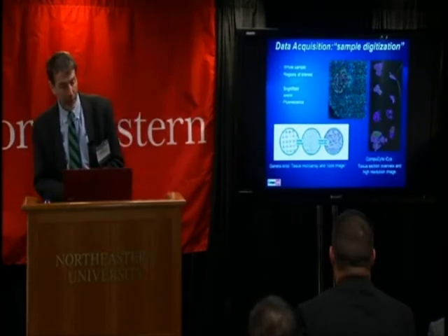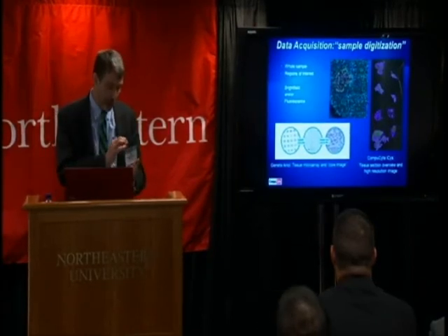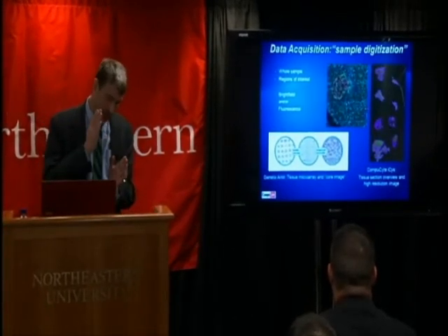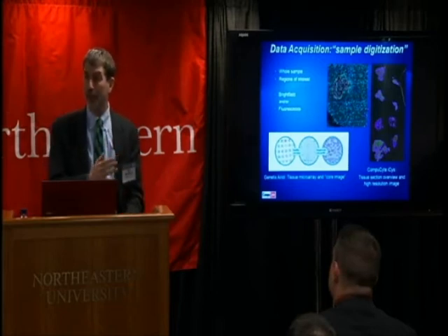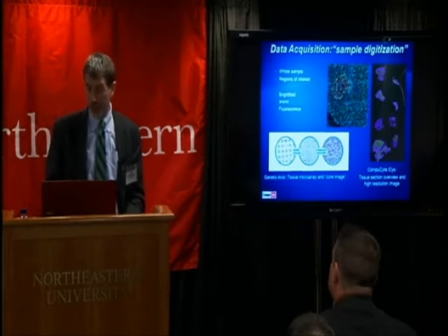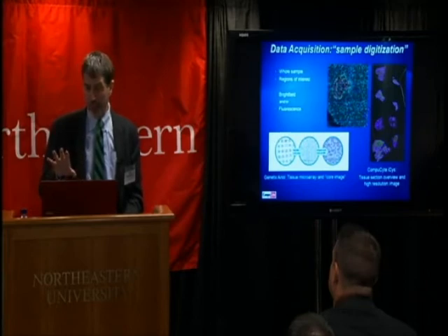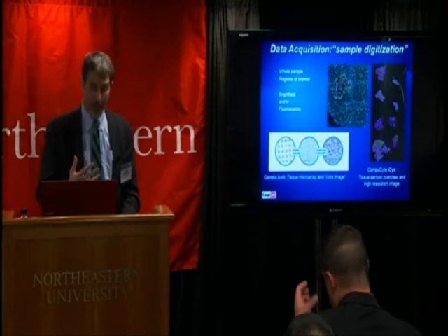One is a bright field example from the Genetix Ariol on a tissue microarray. Tissue microarrays are essentially cores of tissue that are arrayed and then microtomed very thin and placed on a slide, similar to how a tissue section would be prepared. So that's one example. Another is on a tissue section. This is rat pancreas tissue, where this sample has been imaged at low resolution, and then that low resolution image has been used to define regions of interest for further imaging at high resolution.